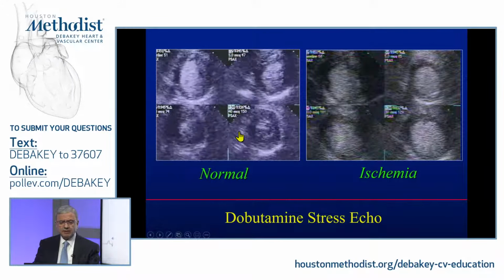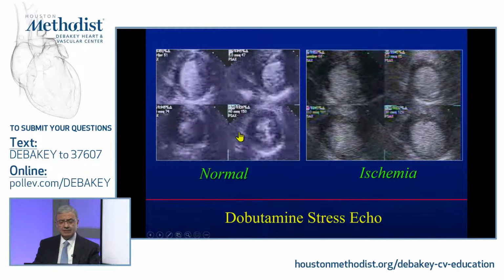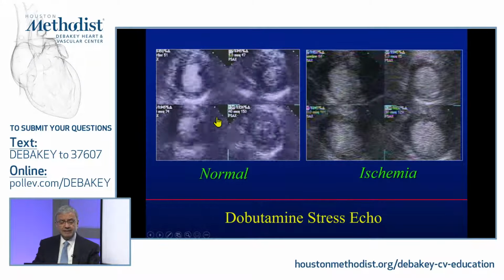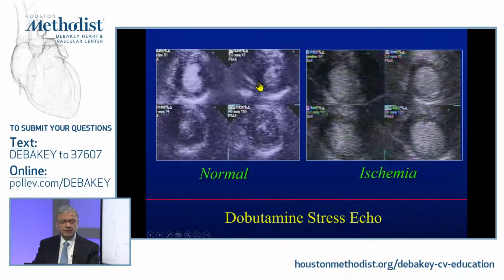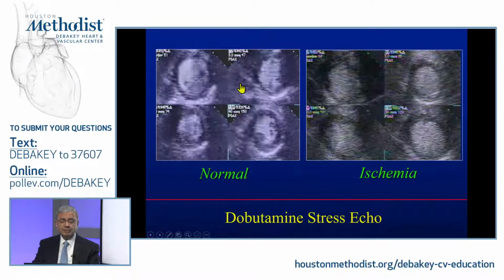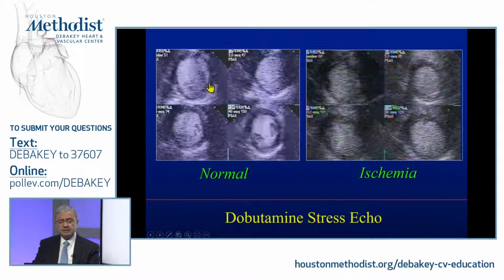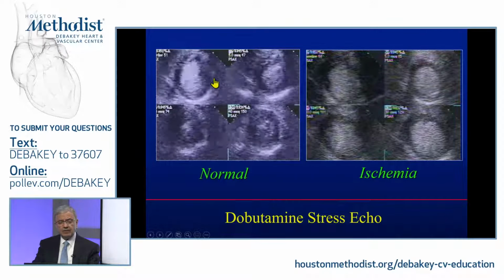For stress, as I said, you want to make sure that you have a full display. You have to decide early on on use of contrast, otherwise it's going to look really funny, and you won't be equipped to use the contrast on time. So make that decision early. If you're going to decide on contrast, use it throughout, from rest all the way.